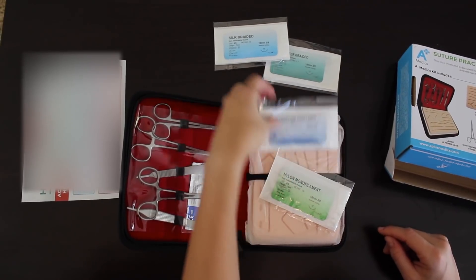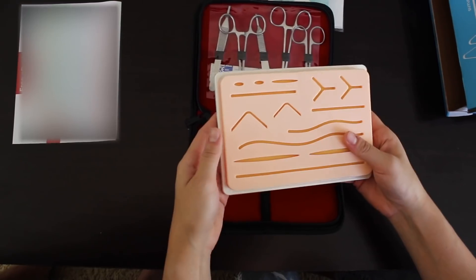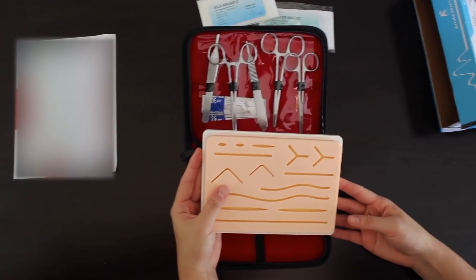Some suture threads here. This is really heavy duty feeling. I like this. Let's get started, shall we?